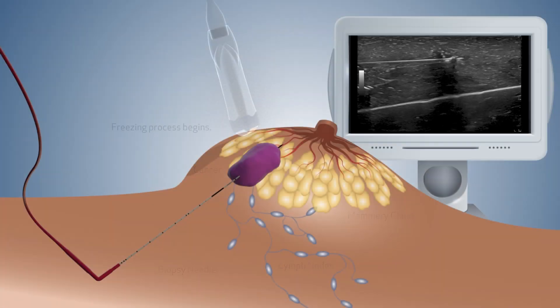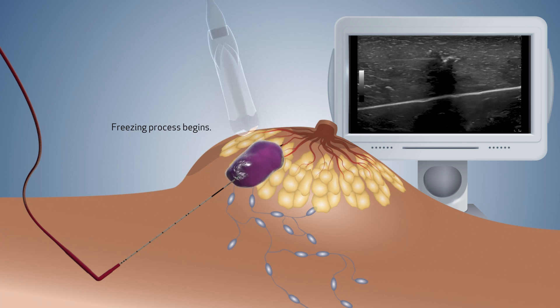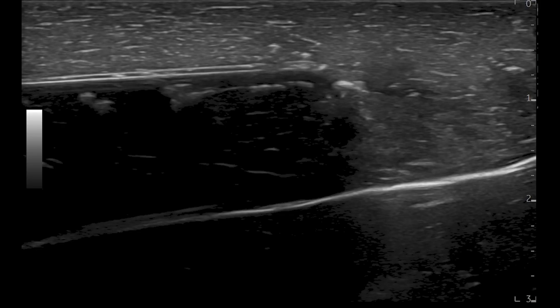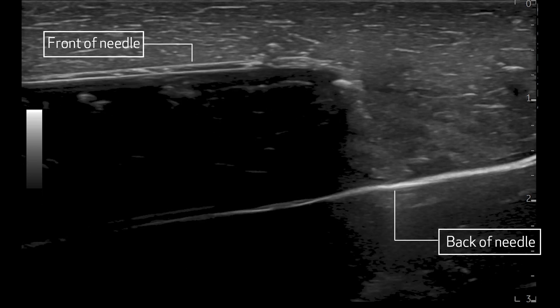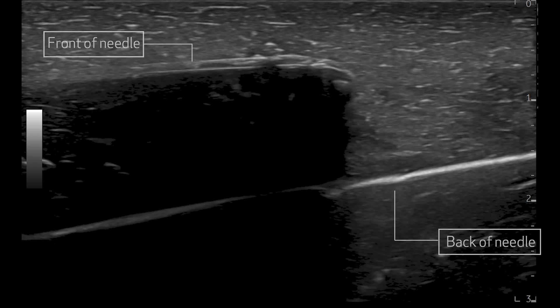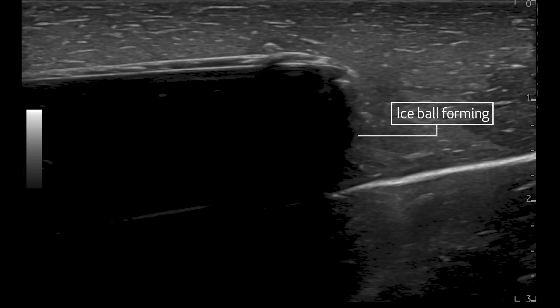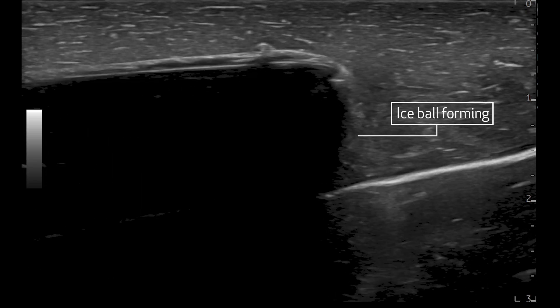Now the physician initiates the freezing process. As the procedure begins, you will notice that the needle becomes highly visible on the screen. The front and back of the needle are represented on the ultrasound by two parallel lines. As the procedure progresses, the tip of the needle starts to form ice, which appears as a black shadow behind it.